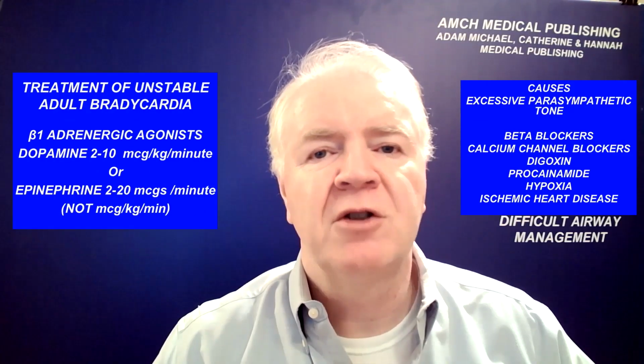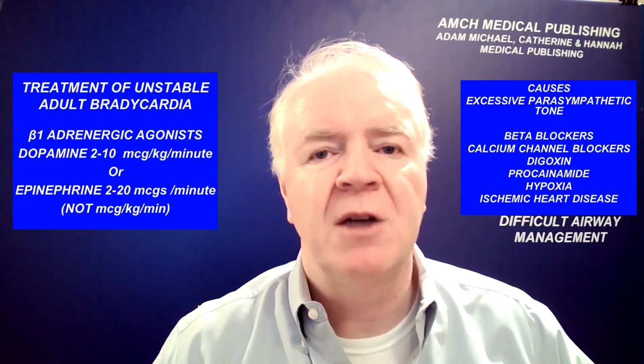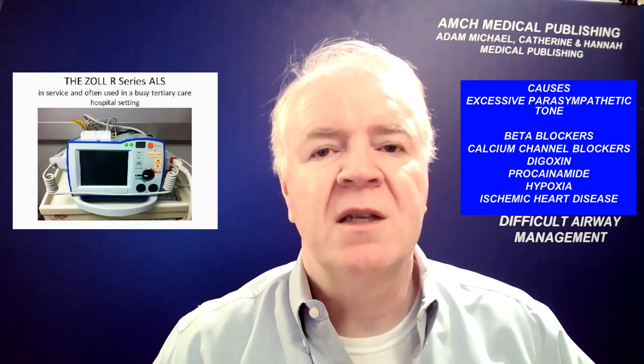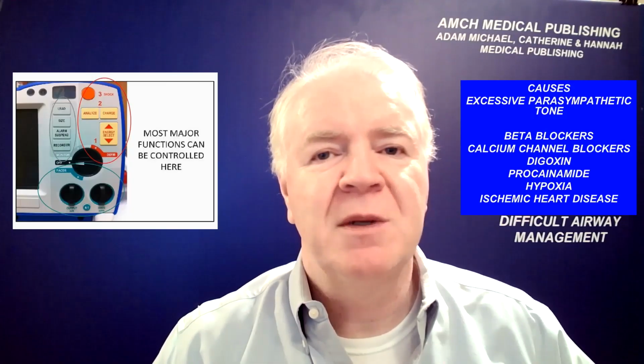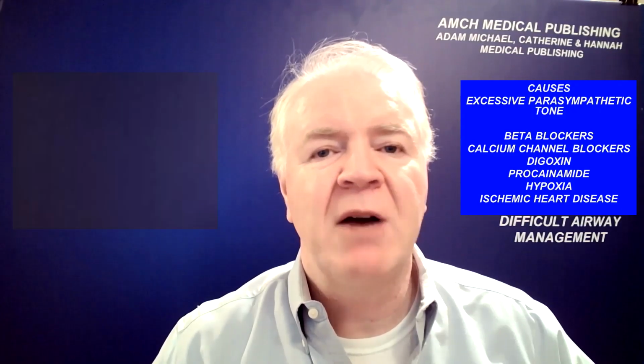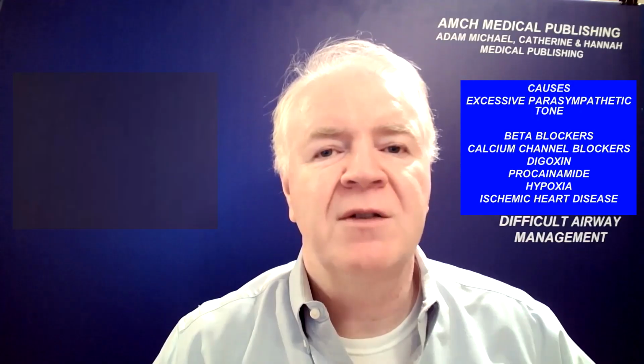Treatment with positive chronotropic drugs is always a temporizing measure, while arrangements are being made for temporary pacing. But this too is a temporizing measure, while arrangements will often need to be made for implantation of a permanent pacemaker. Transcutaneous Zoll pacing is now widely available and is very helpful in the short term. A commonly available alternative is temporary transvenous ventricular pacing.